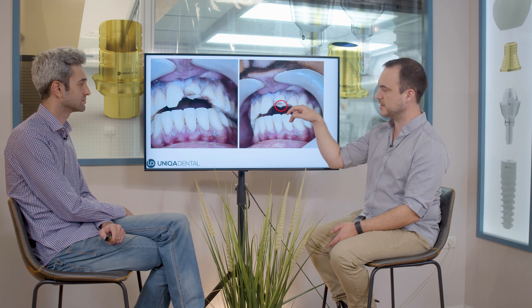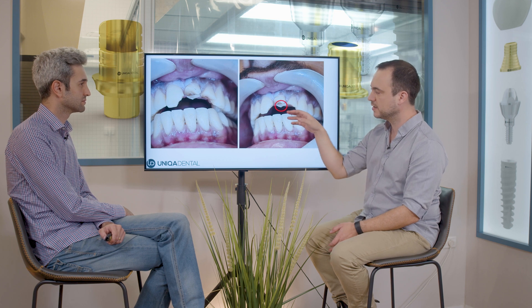The first thing that we did was prepare both of the teeth. You can see the nerve of the teeth here, and the other tooth — you can also see the nerve. There's a broken part of the tooth that you just need to take out. When we started analyzing the case, we saw that tooth 11 also needed root canal treatment because the break was quite deep. We prepared and scanned the teeth, and while the technician made provisional crowns, we did the root canal treatments. After about two to three hours, the technician gave us three crowns in one small bridge, and the patient had completed all the root canal treatments.